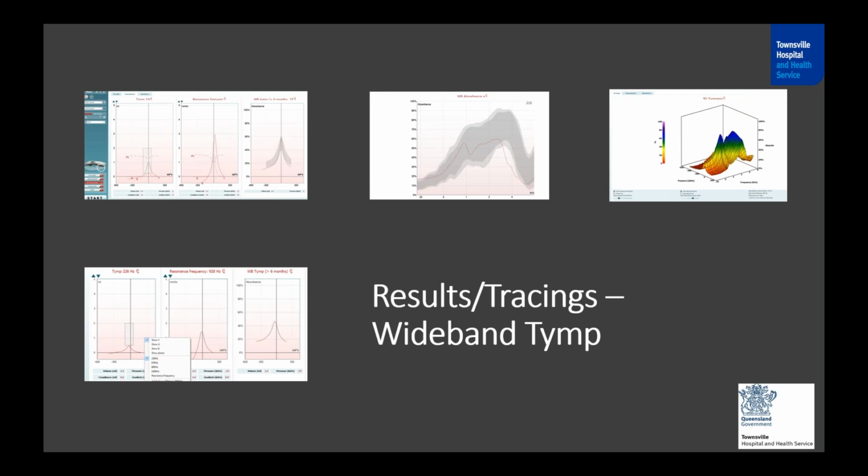Okay. When we say Titan, like Titan and Mimosa, the two companies, Titan provides provision for both ambient and pressurized absorbance, whereas with Mimosa you can do the absorbance at ambient pressure only. At ambient pressure, it's like doing otoacoustic emissions. You keep a probe and give the click and measure the energy absorbed. Whereas in pressurized absorbance, you pressurize the ear canal as well as measure the absorbance. Now, the absorbance is usually given in 1/24th of an octave, which means it gives you a lot of different points and a finer description of the absorbance at individual frequencies. We don't need that kind of finer analysis to do the measurements.